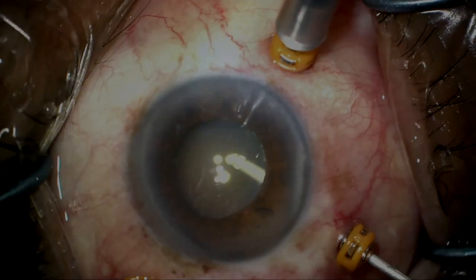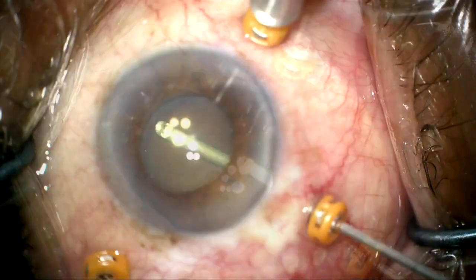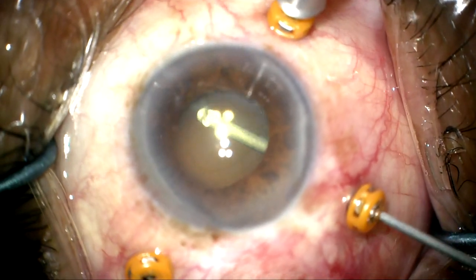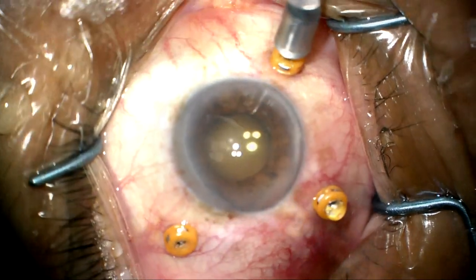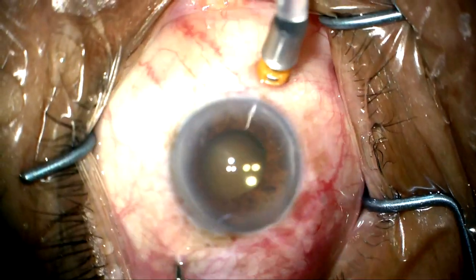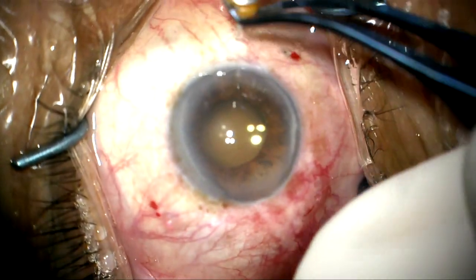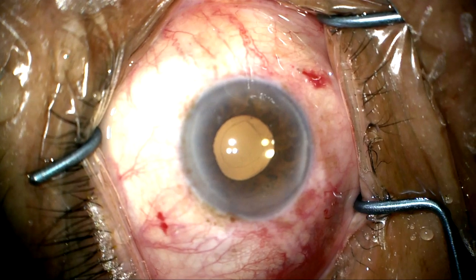Once I feel that this is adequate, I'm going to restore my anterior view and make sure that I've shaped the rexis exactly as I want it and removed all of the lens debris from the capsular bag. And the case is pretty much completed. We now remove these trocars. I like to leave the infusion line last, so it can just give the eye a little bit of final firming up. And this is what the patient looked like the next day at the slit lamp.